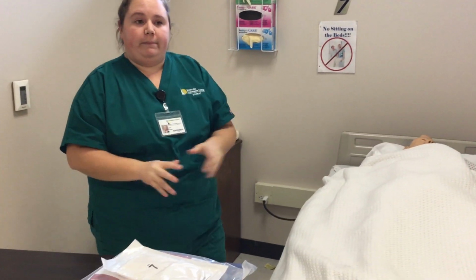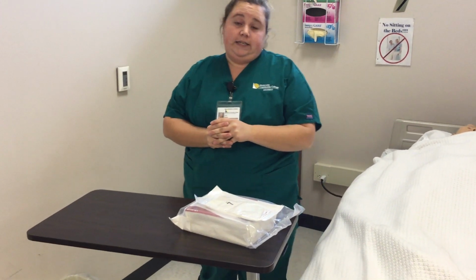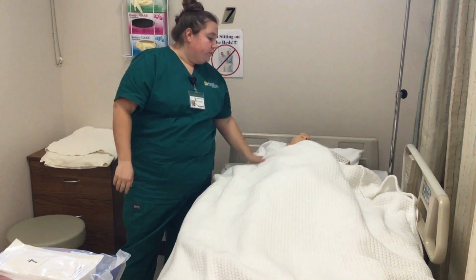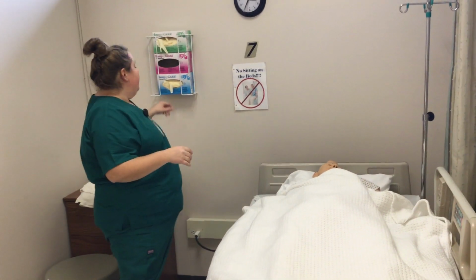At this time, I would get my supplies, which I have, and get another nursing personnel to help assist if necessary. And then I'm going to explain the procedure. Hi, I'm here to catheterize you, and then I'm going to perform hand hygiene and apply gloves.